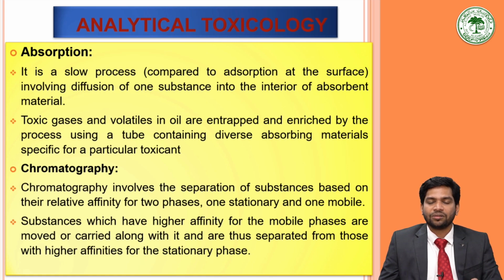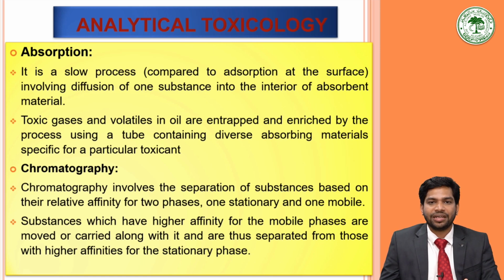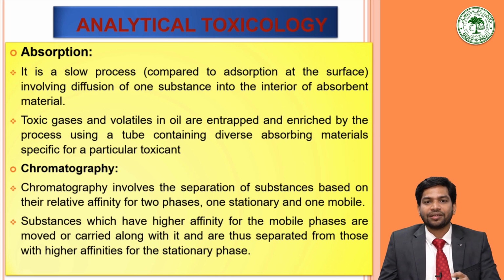Then another good technique is the chromatography. Chromatography, we will be detailing the process of the chromatography in the next class. The chromatography involves the separation of substances based on their relative affinity for two phases, one stationary and the other mobile phase. Substances which have higher affinity for the mobile phase are moved or carried along with it and thus separated from those with the higher affinities for the stationary phase.